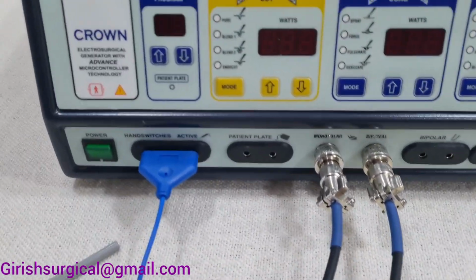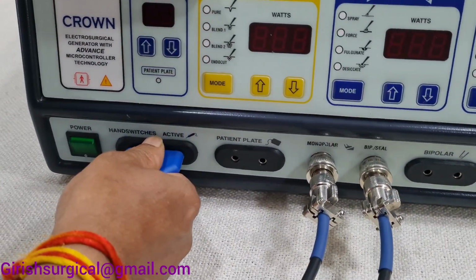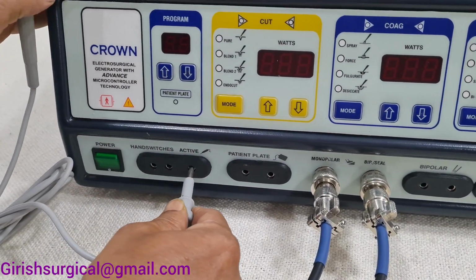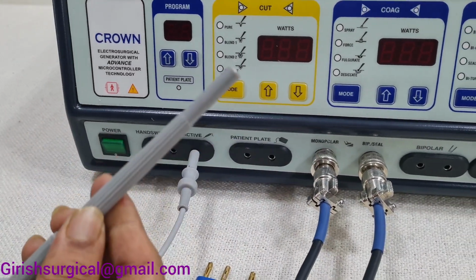In this port also you can see the active connection. When you are using a foot control one, you have to remove the hand switch pencil connection. And this single banana jack pin, you have to insert it here so you can operate it with the foot switch.